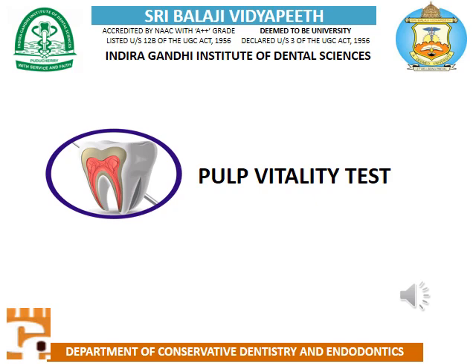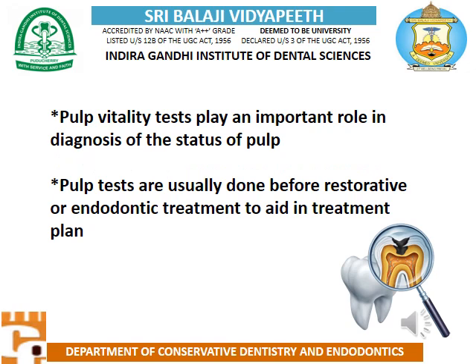Pulp vitality test. Pulp vitality test plays an important role in diagnosis of the status of pulp. Pulp tests are usually done before restorative or endodontic treatment to aid in treatment plan.